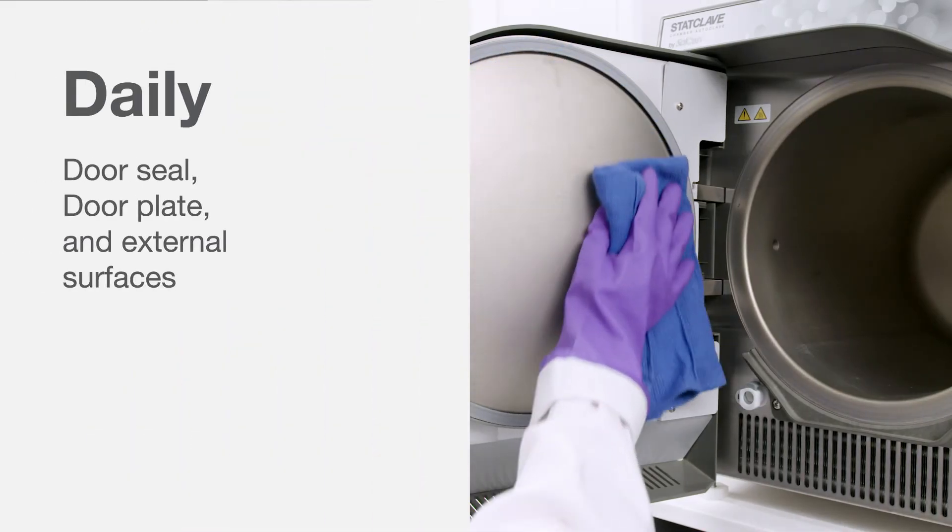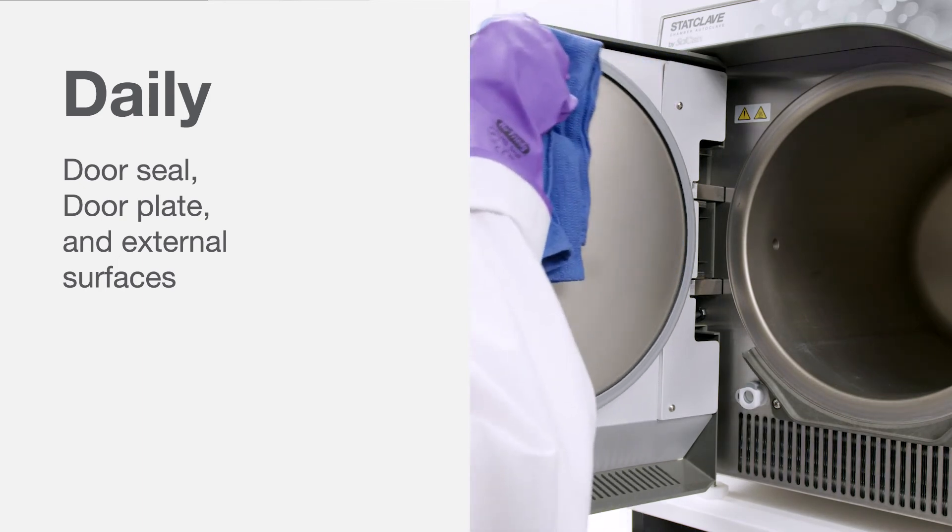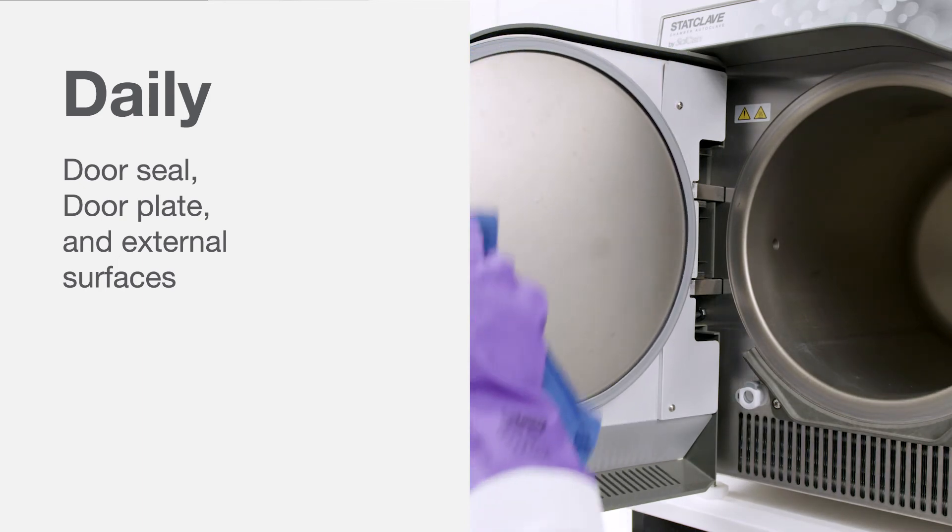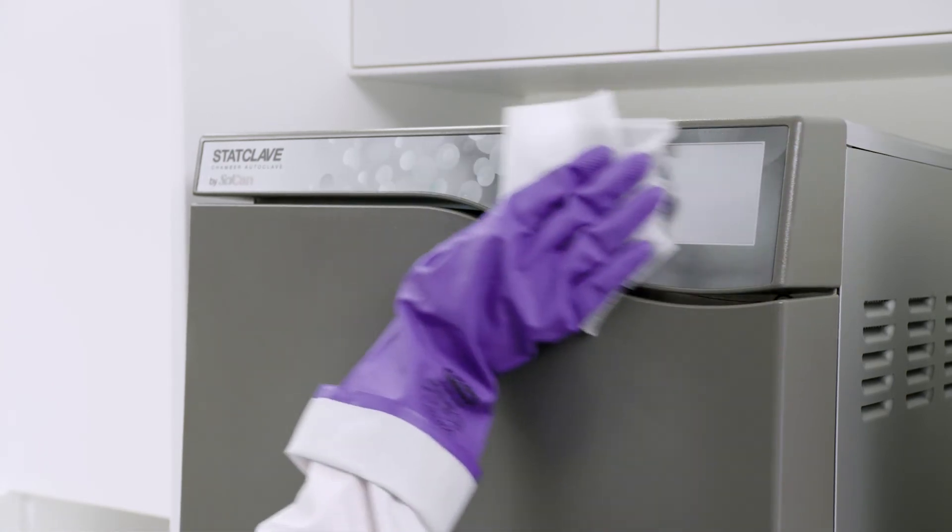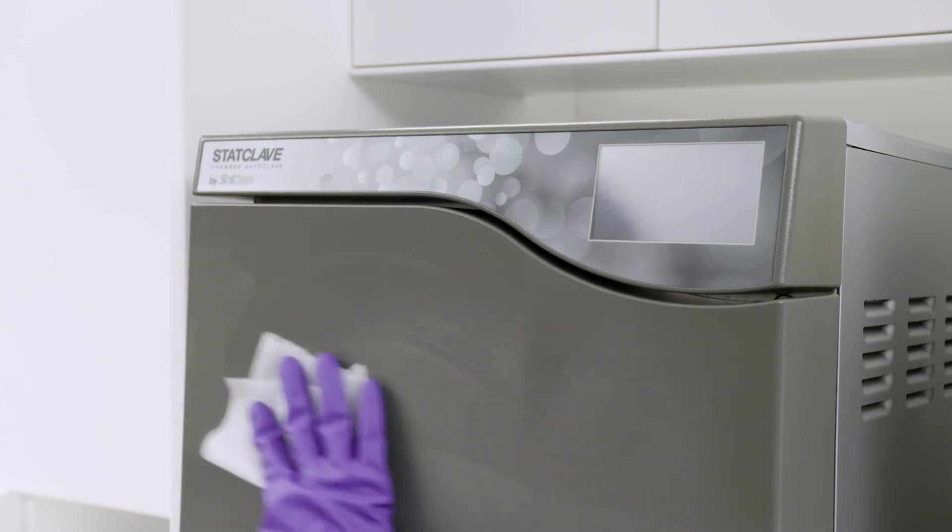The door plate, door seal and external surfaces should be cleaned daily with a damp, lint-free cloth. Clean all the StatClave's external parts using Optum wipes or a clean, lint-free cloth dampened with water and, if needed, a mild detergent. Dry the surfaces and remove any residue before powering on the unit.